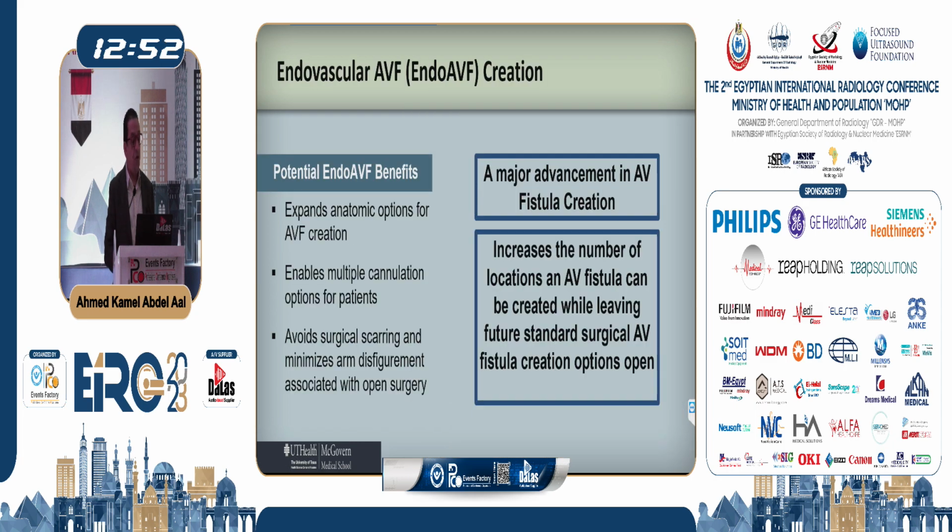So the creation of dialysis fistula using the endovascular or interventional technique has several benefits, and it's a new innovation. First, it expands the anatomic options for AV creation. Number 2, it enables multiple cannulation options for these patients, and it avoids the surgical scarring and minimizes the disfigurement in the arm, as we're going to see in a second. So let's talk about each one of those.